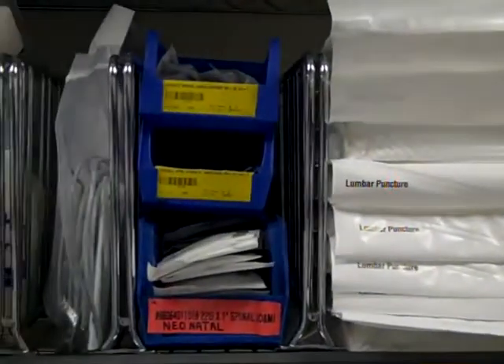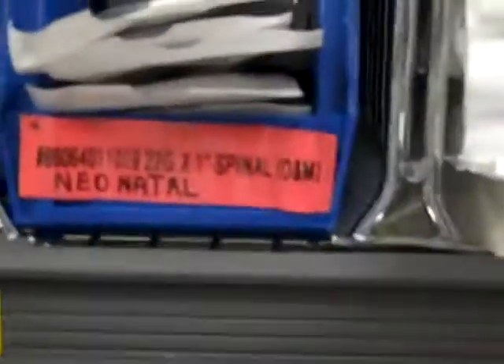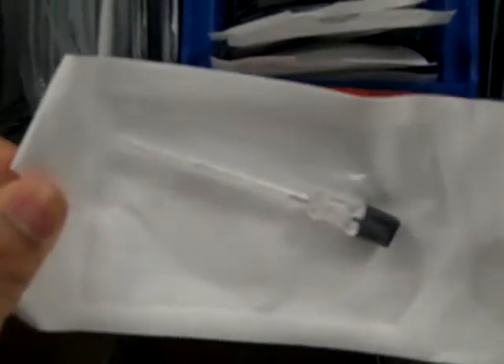The other thing you'll need is usually an extra needle. The needles are located directly to the left of the LP trays. Needles come in a couple different varieties — there's adult and pediatric. The pediatric is listed right here as neonatal, and you'll see that it's a very small needle appropriate for use in the pediatric population.